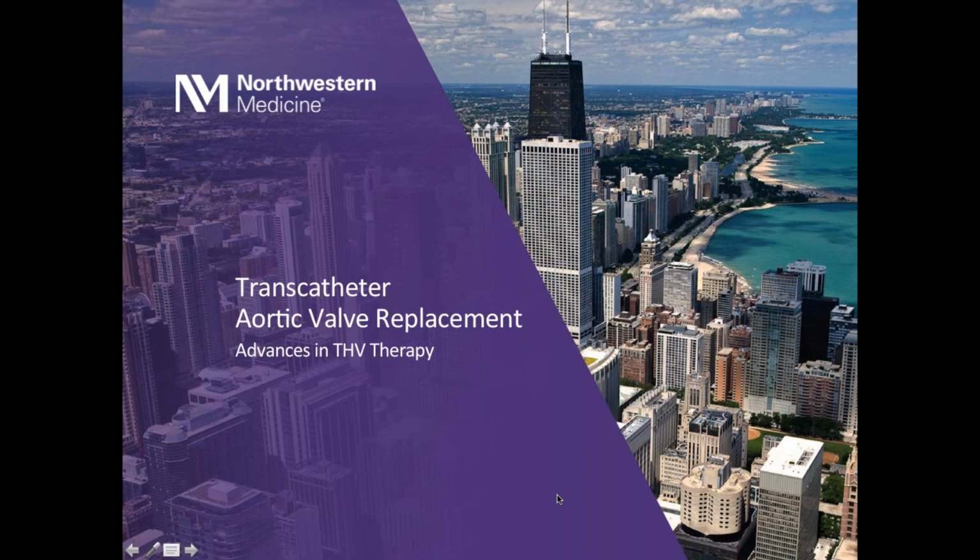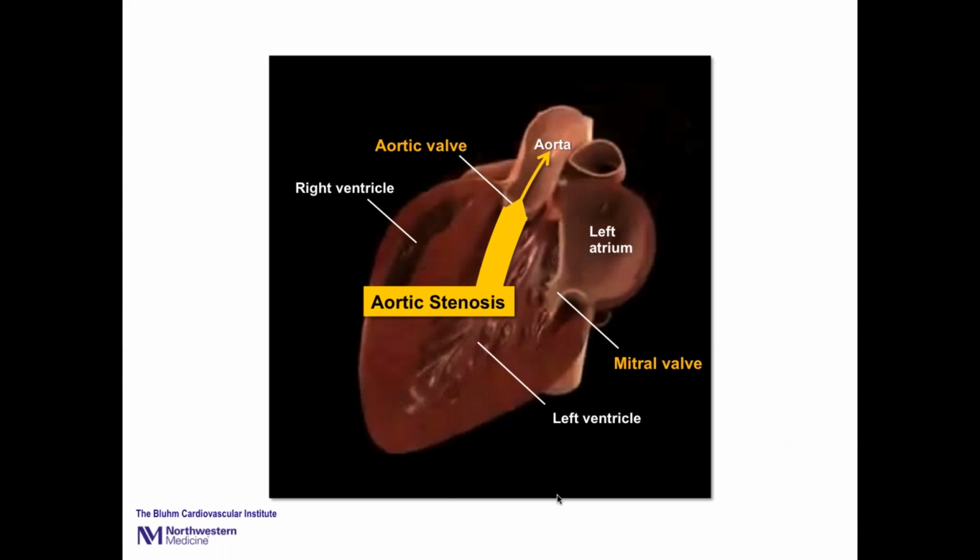And then I think we can go to the next slide. Traditionally, open heart surgery was the only way to take care of patients who had degeneration of their aortic valve, typically called aortic stenosis. Approximately 8 years ago in the United States and about 10 to 12 years outside the United States, there was, as Pat said, a revolution in therapy which allowed replacement of the aortic valve with catheter-based therapy, which most often can be done through an artery in the leg.